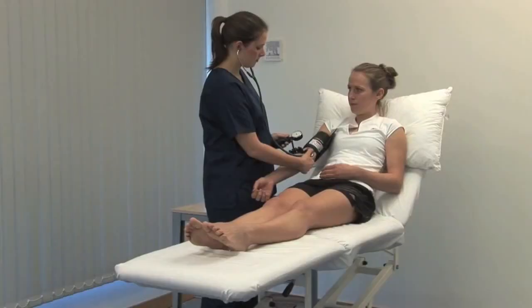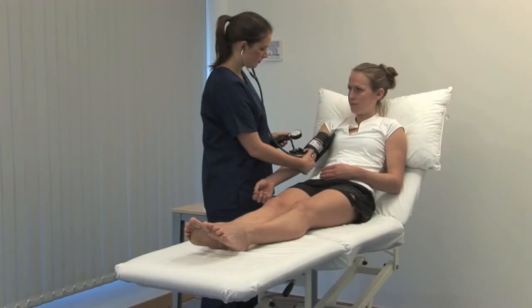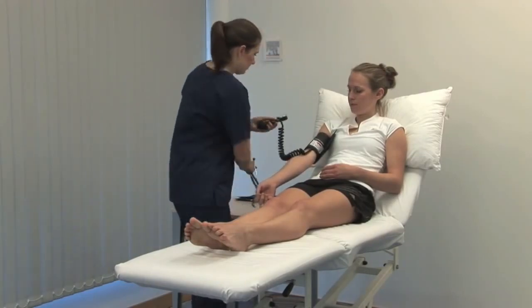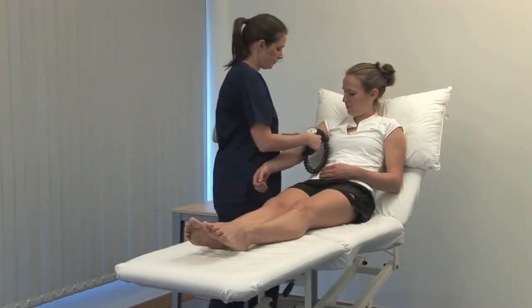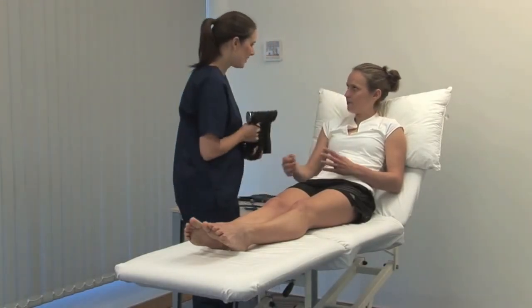Continue to slowly deflate the cuff until the sounds disappear. This value is the diastolic blood pressure. More detail about Korotkoff sounds are in the text.